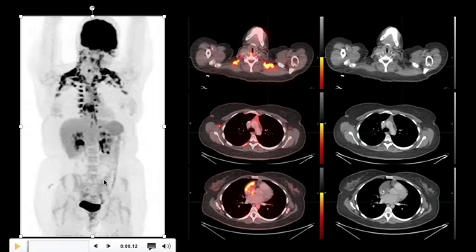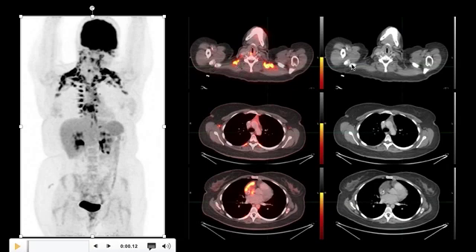This is a great example of brown fat uptake which is seen in the supraclavicular regions, posterior neck and posterior intercostal regions. This is a representative transaxial fused image showing intense uptake in the right and left supraclavicular regions corresponding to fat attenuation on the CT.